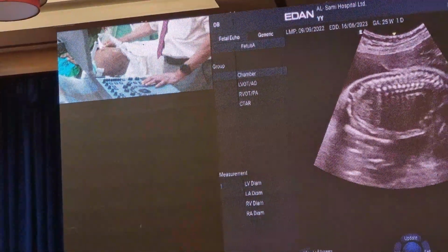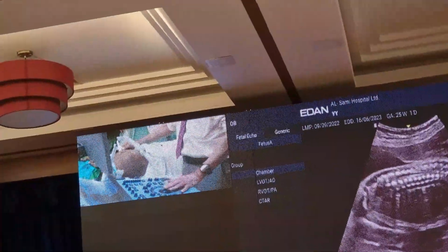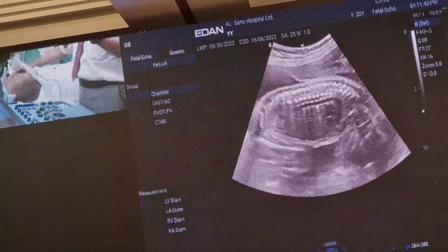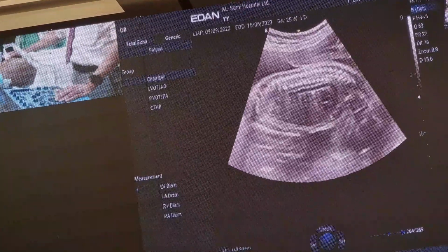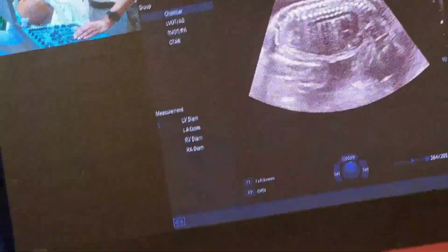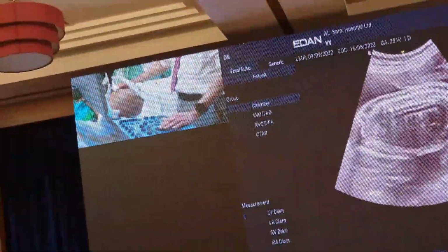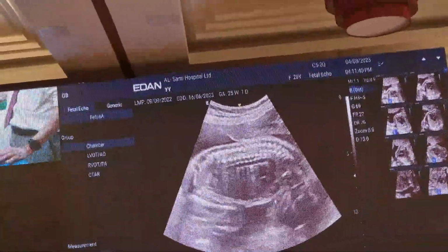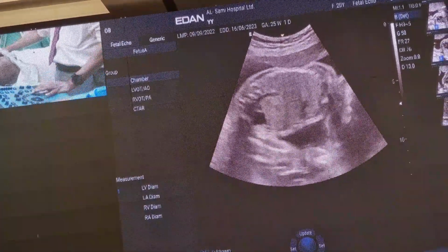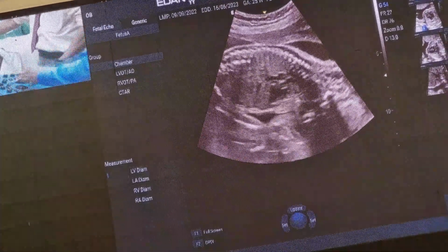Yeah, but the baby started moving. Now increase the gain. So I mean I'm not on a very good view. I'll try again. But the point is that the ductal arch is a broad arch because the right ventricle is closer to the sternum. So it goes all the way and it goes down into the descending aorta, and we do not get any branches in the ductal arch. Why? Because there are no branches which come from the ductal arch. Okay. So it is basically the pulmonary artery which gives rise to two branches and then it continues as the ductal arch.